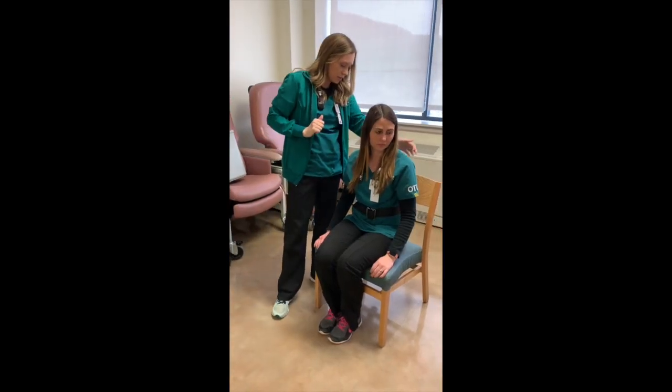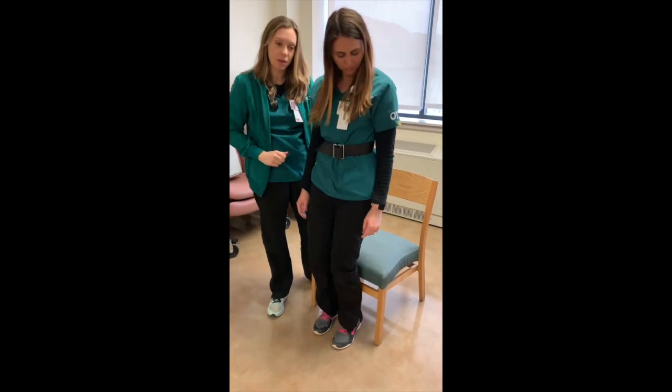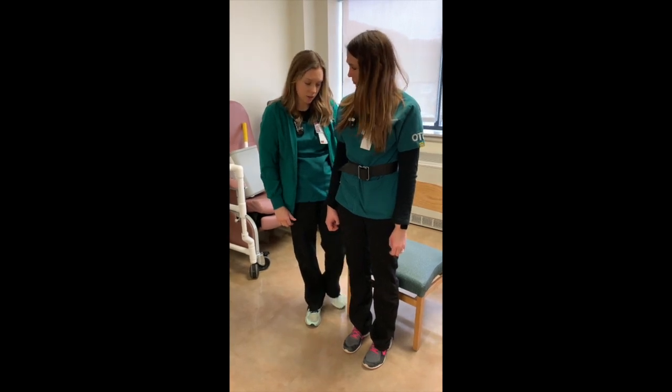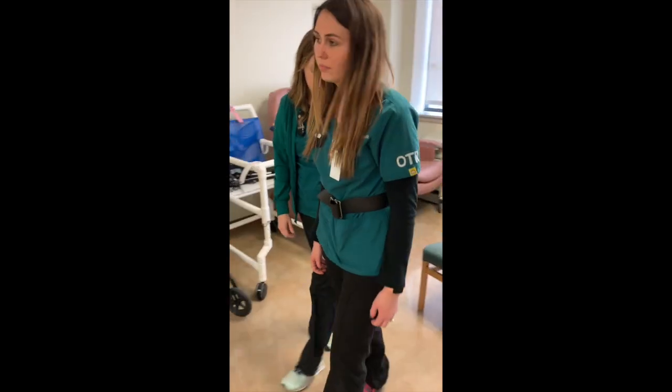All right, so when you're using a gait belt, we're gonna put your hand on the back of the gait belt and have the patient stand up. The idea is that you can keep a hand on the back of the gait belt so that you're close to the patient in case they need you. And then you're just gonna stay close and walk.